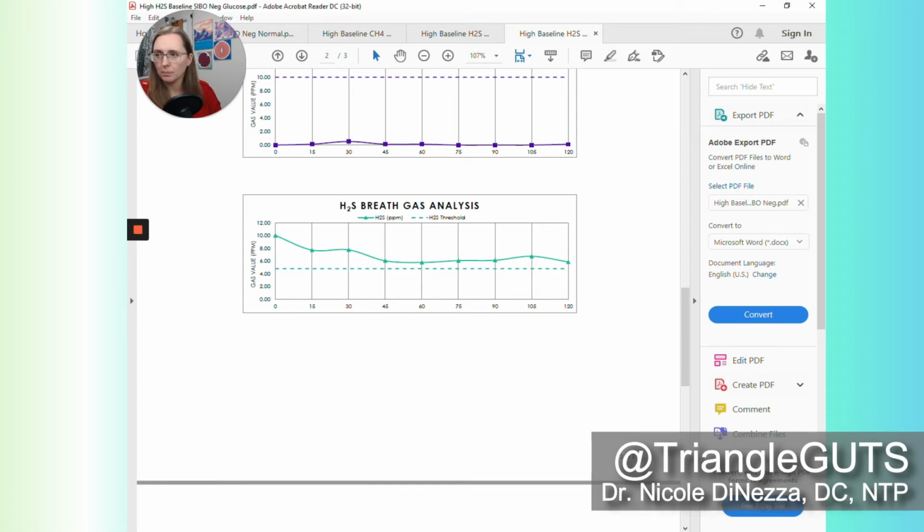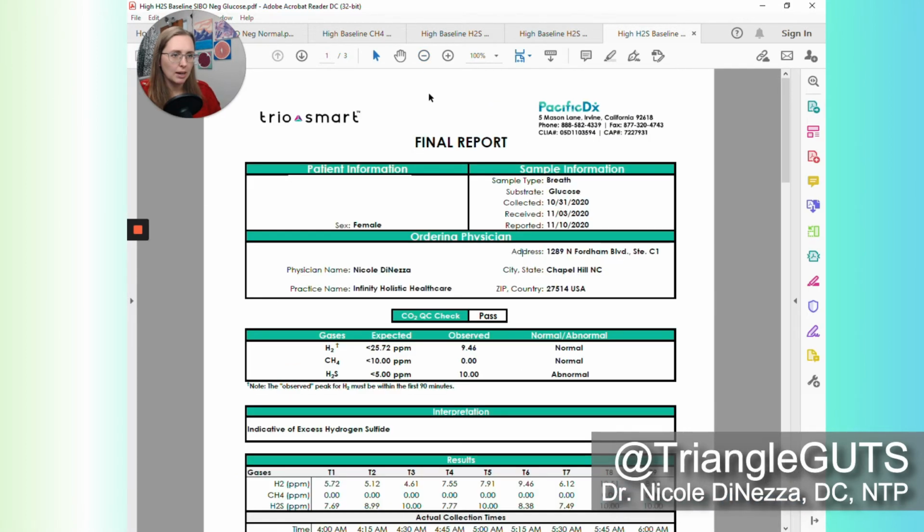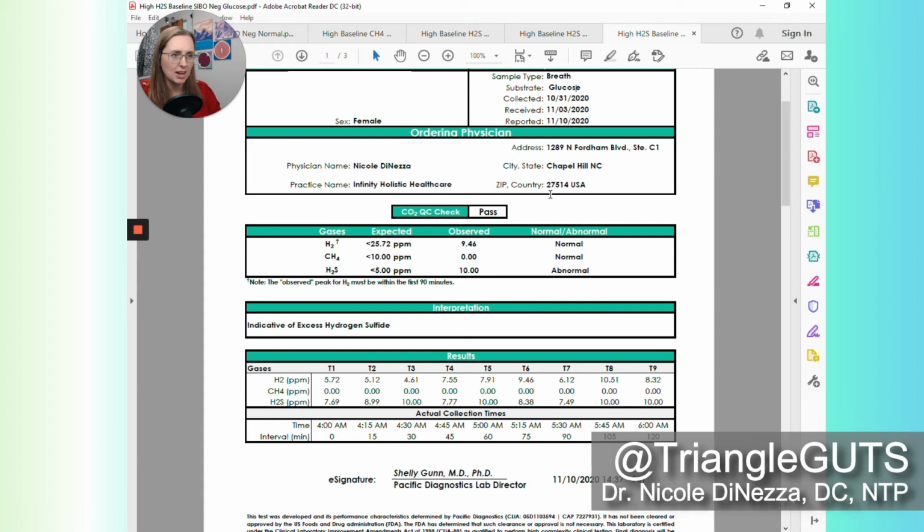Onward we go. All right, here's another test. This is a glucose test, so we don't have to worry about speeding up the transit time. So that is a good consideration to take into account. We have a quantifiable number for all of the gases, or at least 2 of the gases on these samples. So we know that all of these are valid samples. And we can see yet again, it's saying that this is indicative of excess hydrogen sulfide.